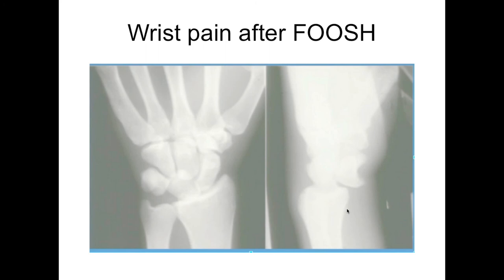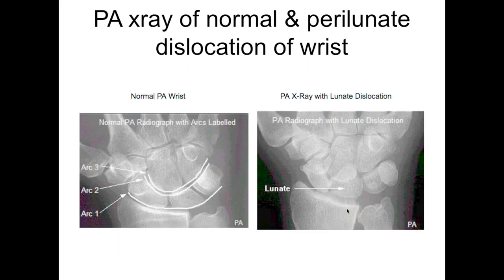What fracture is this? Look at the lateral view — where is the lunate? It's the spilled teacup sign. That cup tipped over means this is a lunate dislocation. On the AP view, the lunate is described as triangular and is now overlapping the capitate. That's a clear sign you have a perilunate or lunate dislocation.